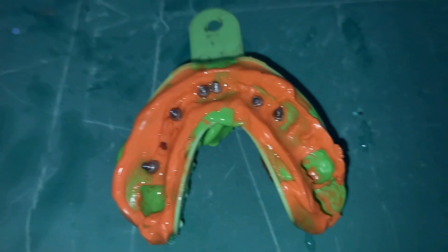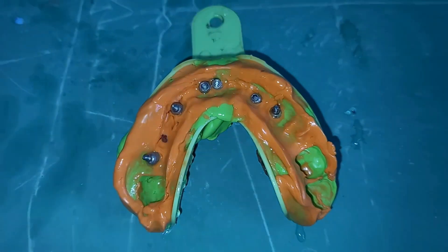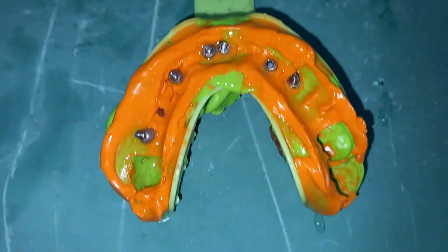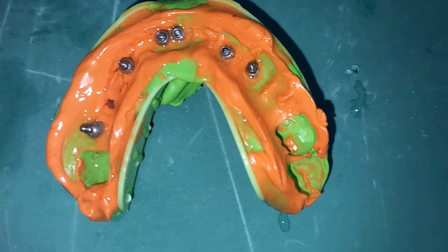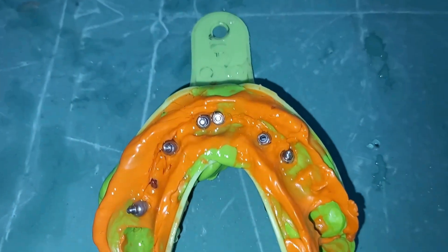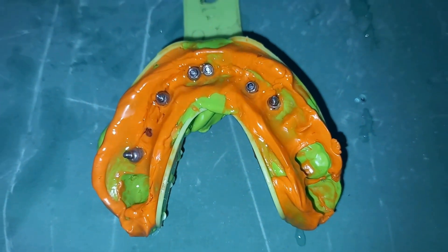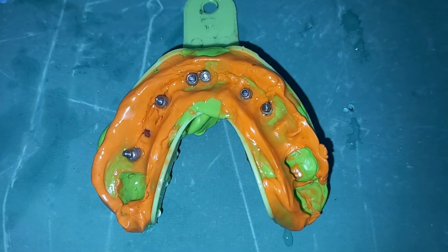In the double step technique, we first take a putty impression, wait for it to set, remove the impression, scrape it, then place the light body on the impression and take the impression again. That is the two-step technique, whereas the one we are discussing is the single step technique, where light body and putty are used simultaneously in a single step.